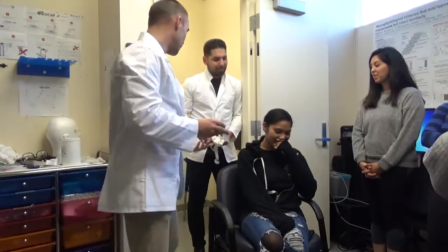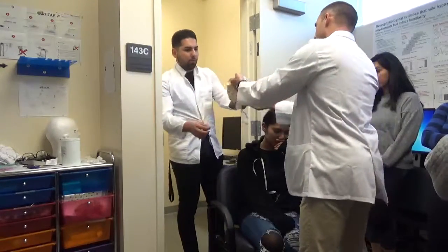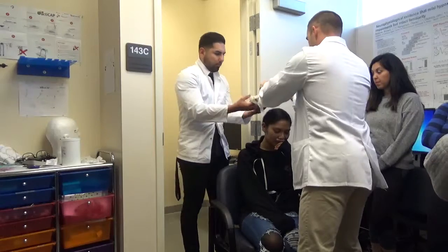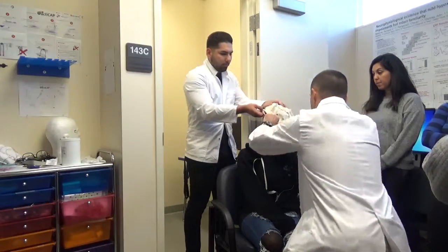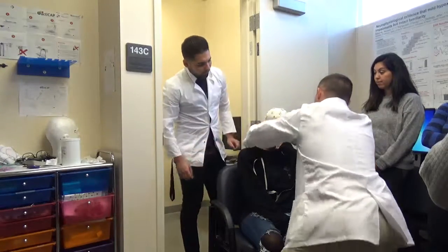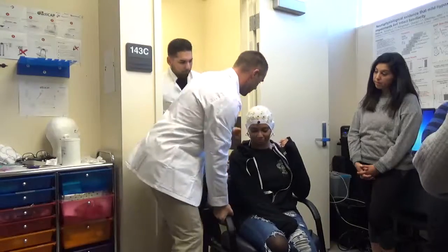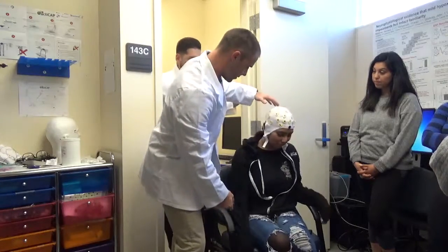Okay. So let's try this again, and do that front side. Okie doke. There you go. Just pull it back nice and gentle. Feel a little bit better. Okay. So see how this is centered right here. So I'm going to ask you to move over. All right. Can you sit in the center of the chair?